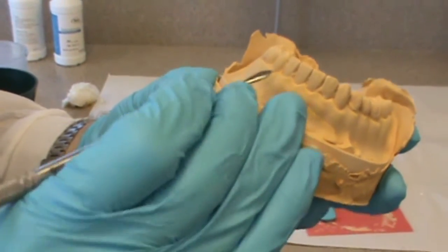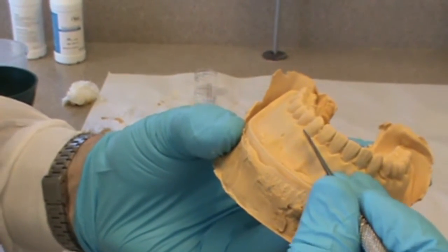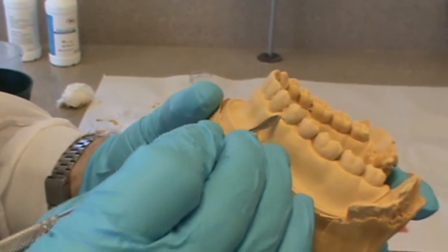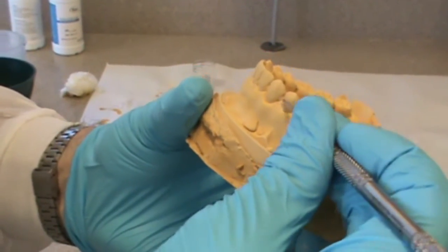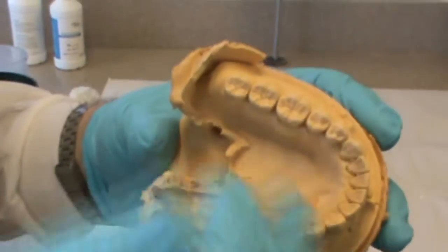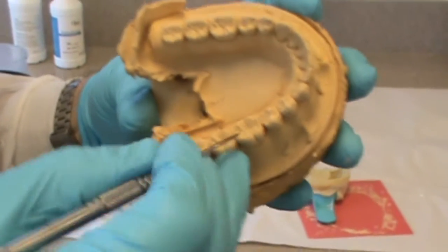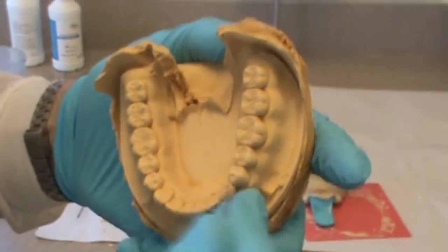For a closer look at the teeth and casts — there will be little blebs or nodules of stone. I use a number seven wax spatula, though you can use a variety of instruments. If you go right to the edge of those little blobs of stone, they should break off relatively easily. The smaller the bubble, the easier they break off. There are almost always bubbles on the occlusal surface and you need to remove those, as they'll interfere with how the casts come together when you place the maxillary cast on top of the mandibular.